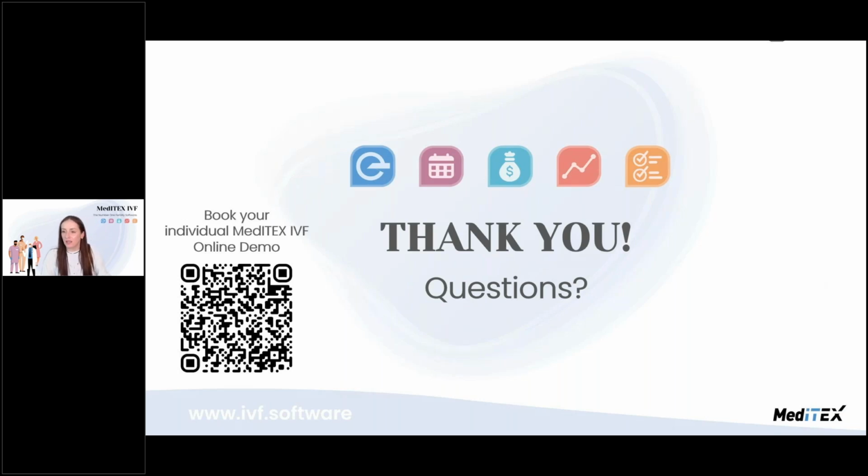Some integration with electronic witnessing systems. Yes, we support eWitness, RI Witness. It is possible to integrate with those systems, of course. I would also like to mention that I'm going to send you a list after this webinar with all the different interfaces and all the different modules we provide and we support. Then you can have a look through it, and should you have any questions in the meantime, while checking this list, just feel free to book a one-on-one meeting with me, and we can talk about your specific questions.